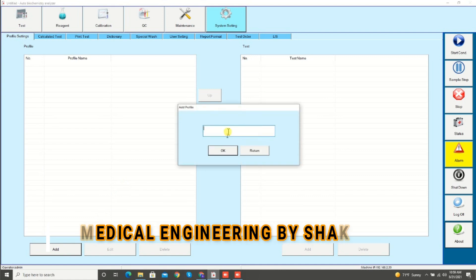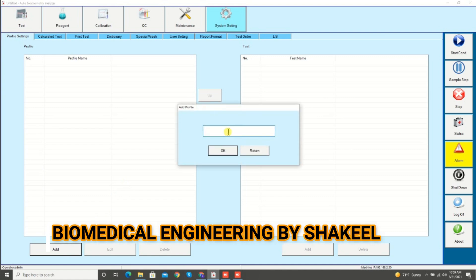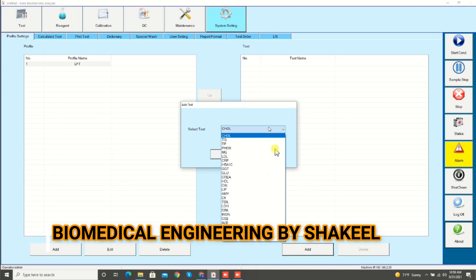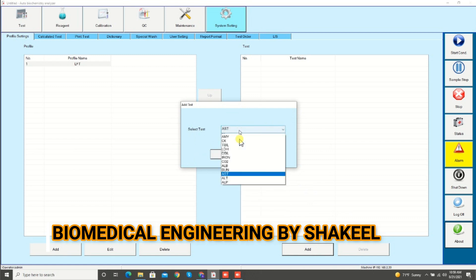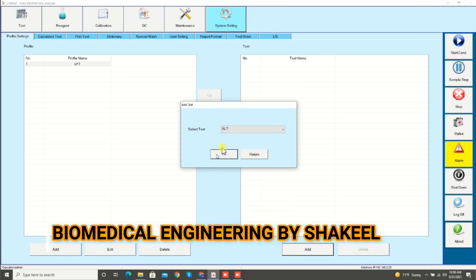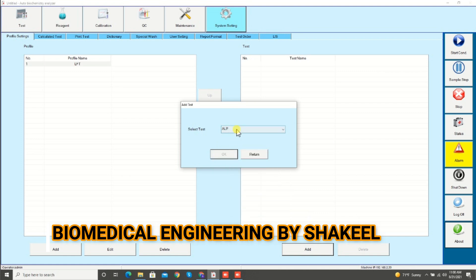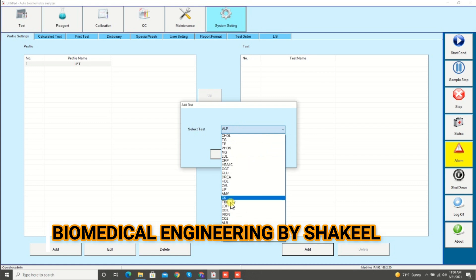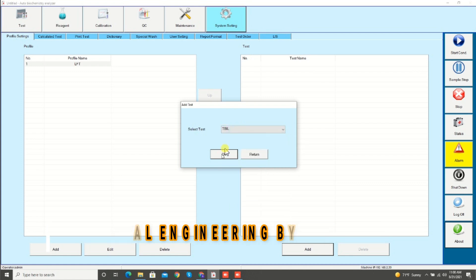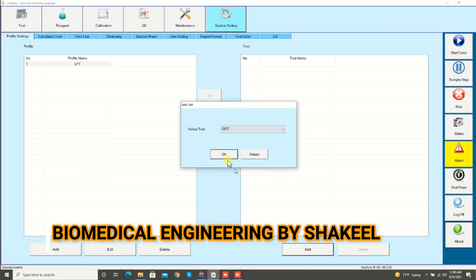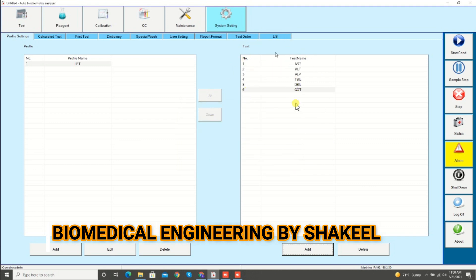Now I will tell you how to enter a profile. Suppose I want to make a profile for LFT — type LFT, click OK. The left side is for the profile and the right side is for the tests. Select the tests for LFT: AST, ALT, alkaline ALP, total bilirubin, direct bilirubin, and GGT. In this way we can make a profile. Same as, you can make more profiles.